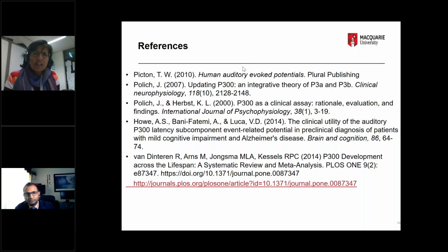Coming back to your point about communication disorders, absolutely, in brain injury cases, speech production, aphasia cases, where they cannot tell you, you can use P300. We're not diagnosing, but within a test battery, you can start to see how this can be used. For instance, I came across a case of a glioblastoma, I think that's what it was. He had to have his right frontal lobe removed, and he came out of that with absolutely no appreciation of speech. His audiogram was mild to moderate.